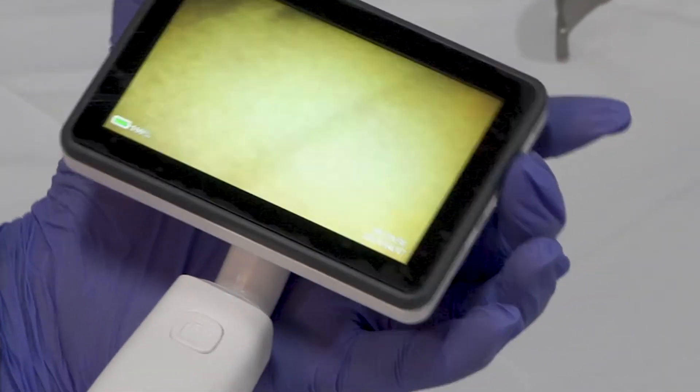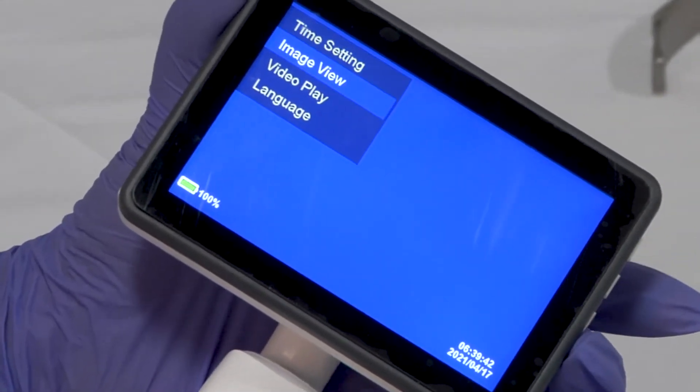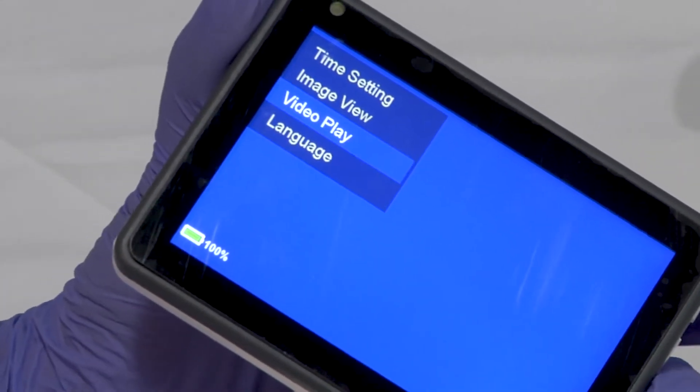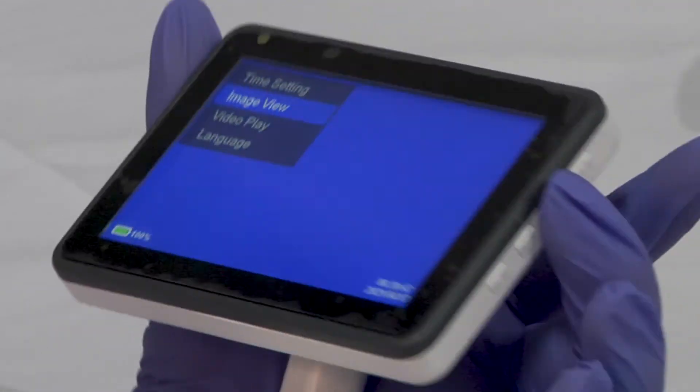Press the M button to enter the menu using the up and down buttons to select. Then press the M button again to enter the selected option.